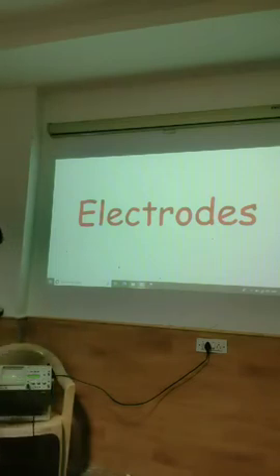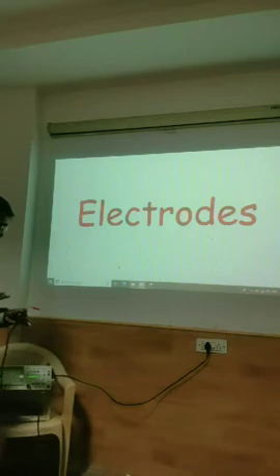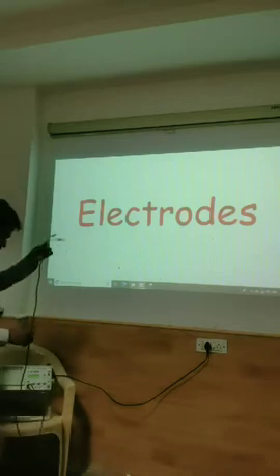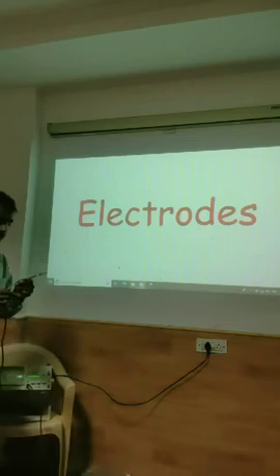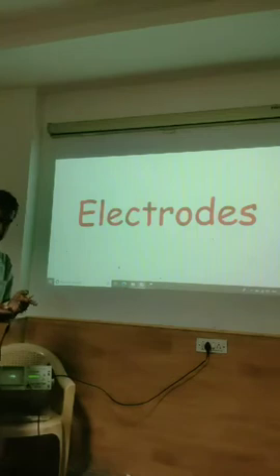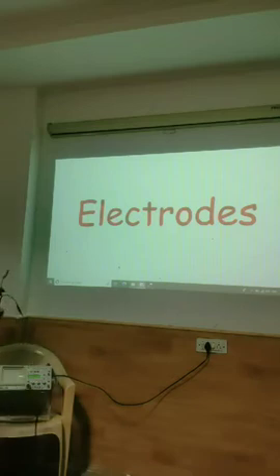Here you can see that there is no signal, right? So I'm going to perform a basic measurement operation. There are two lines here. This wire is called a probe, right? A probe is the wire which is used to carry the signals. Now you can see there is no signal.